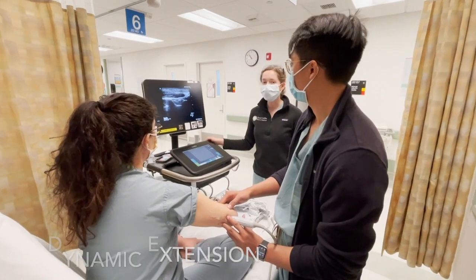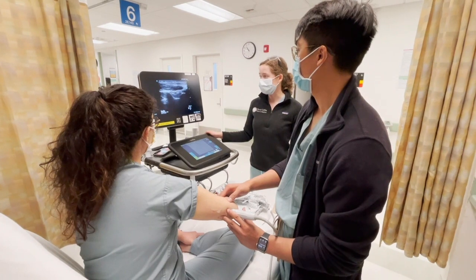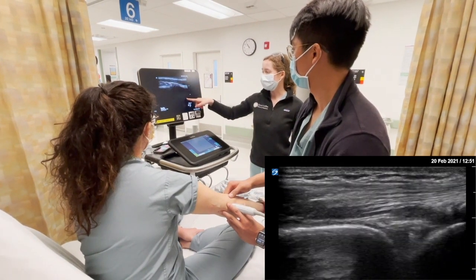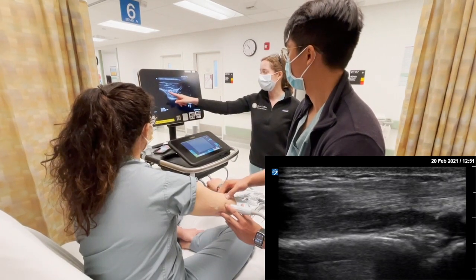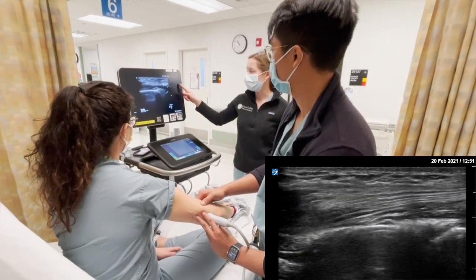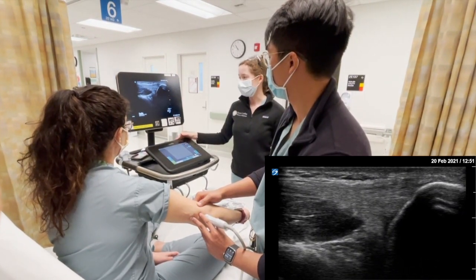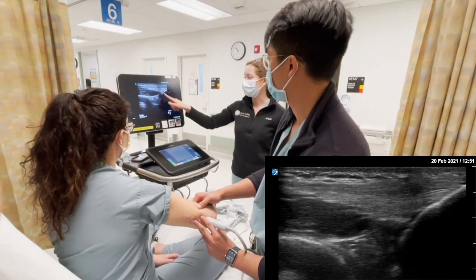Another thing we can do while looking at the elbow is have the patient flex and extend their elbow and watch how the triceps tendon moves with the olecranon coming into view. With extension and flexion we can see the fat pad coming in and out of view. When taking x-rays of the elbow, you want to get them with flexion so that you get a really nice view of the fat pad.